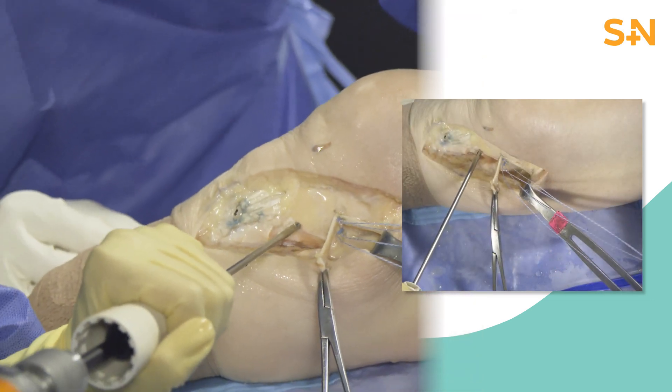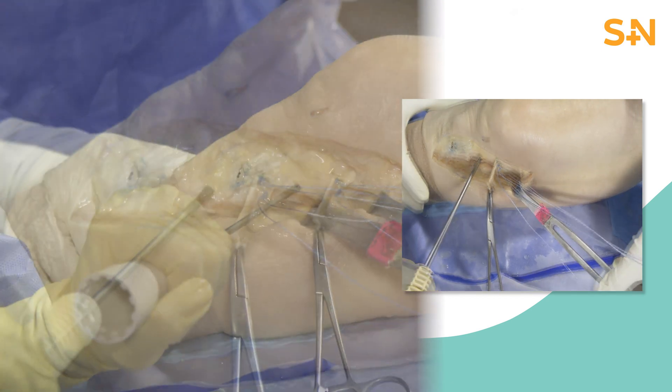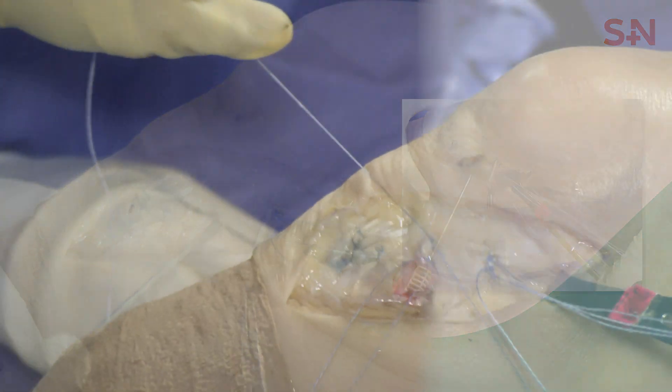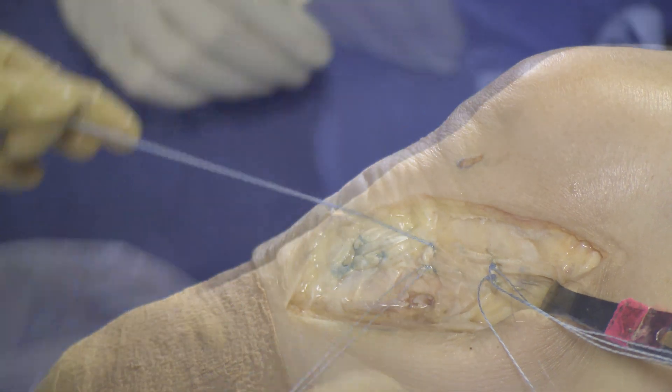Next, we place two additional QFIX all-suture anchors 6 cm distal to the joint line. These sutures are then passed through the more distal fibers of the MCL and secured to repair the distal insertion of the superficial MCL.